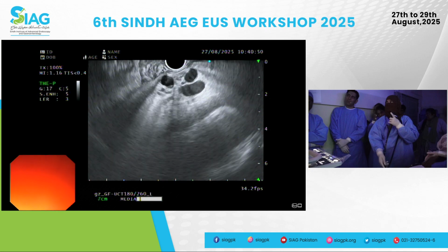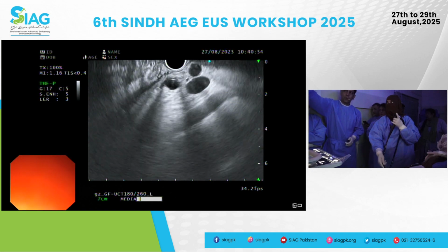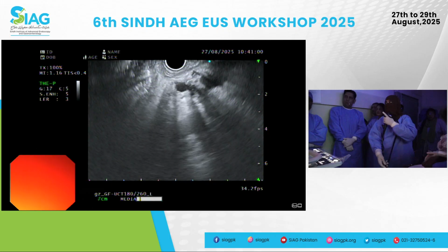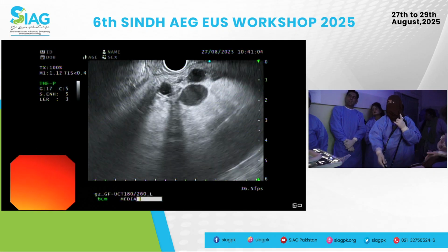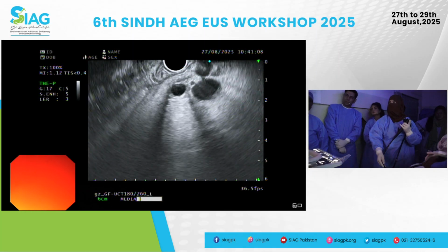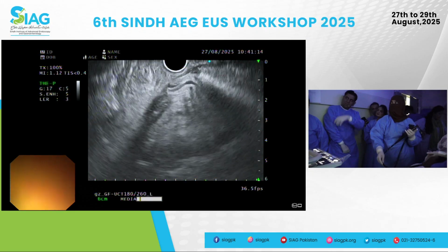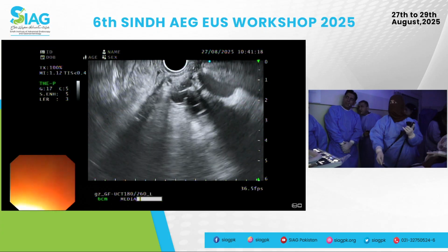This is the last part we can see. That's fine. I think you've gone exactly back to the aorta with the celiac and the SMA. So let's go back again to the neck of the pancreas where we were before. Focus on the neck. Good, good. Follow it toward the neck of the gland. Either you can follow it, or you can look at the splenic vein and see where it joins the portal vein confluence. So what are you seeing here?